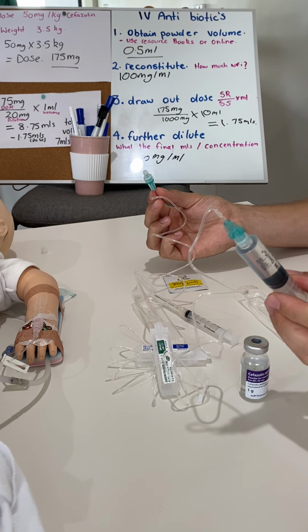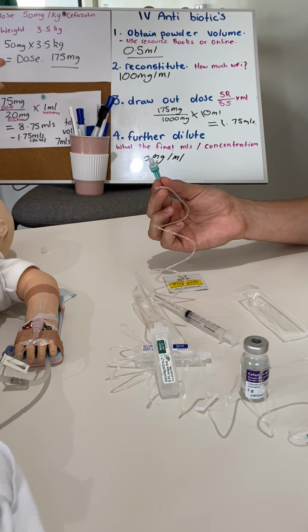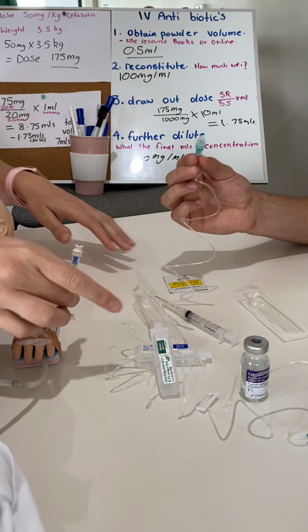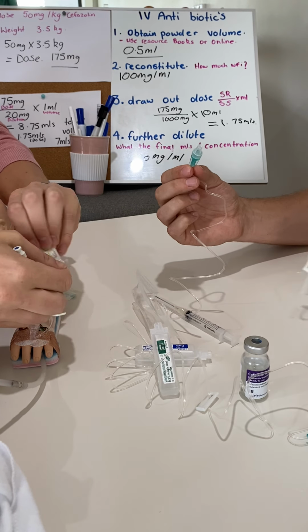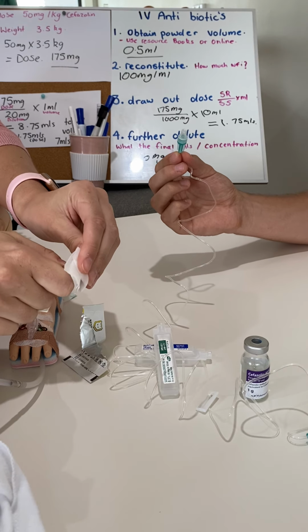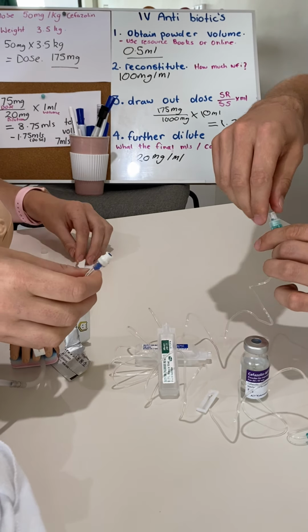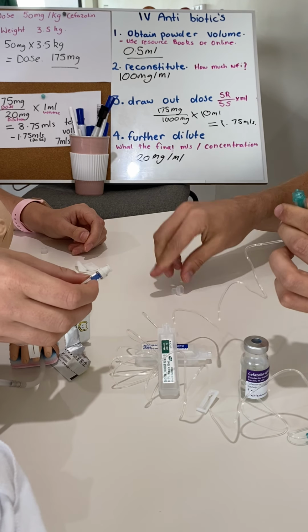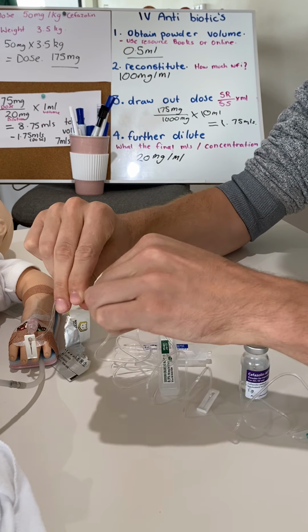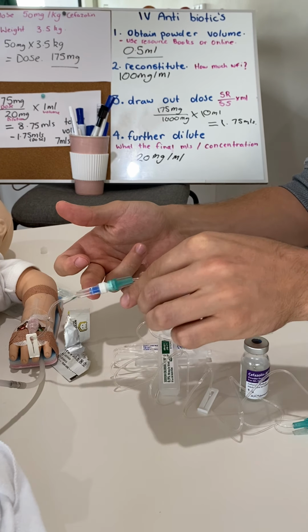When going to the baby, we then need to check that we've got the right patient, the right time, the right route, and no allergies with the family. Once that's done, we can give our smart site on the end of our cannula 15 seconds scrub the hub, let it dry, and we can connect it to our syringe. And this can now run as normal.